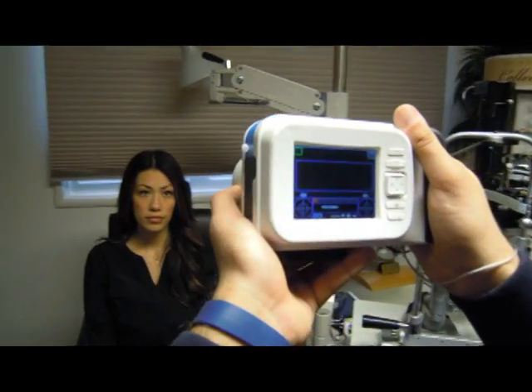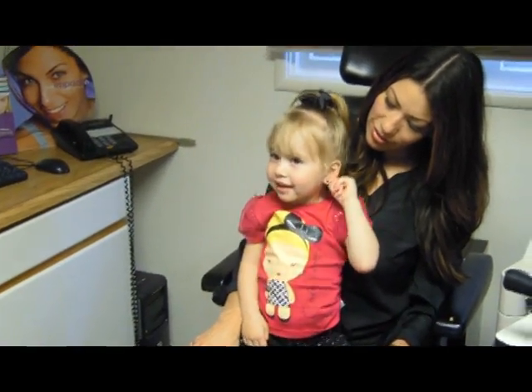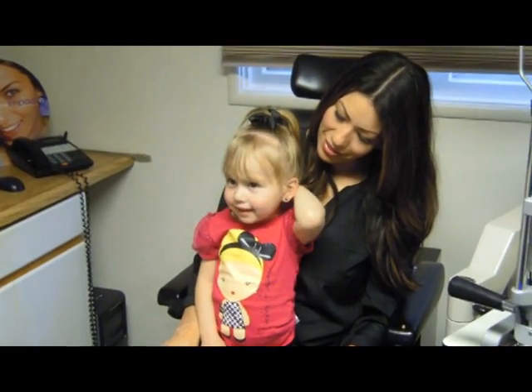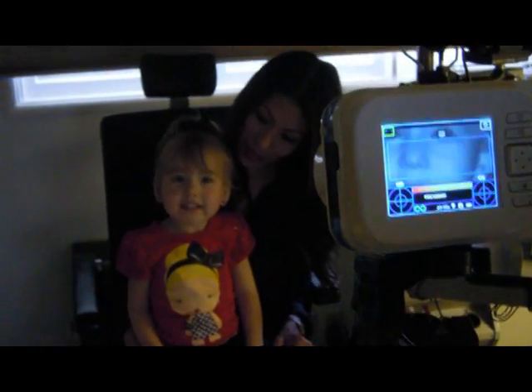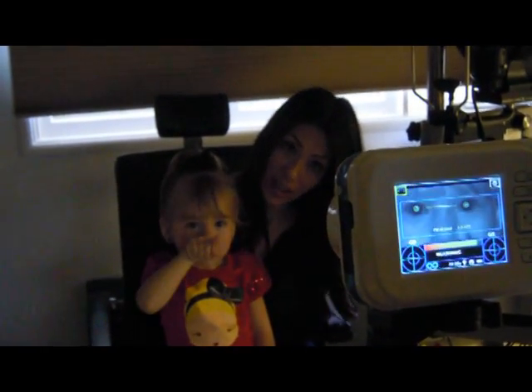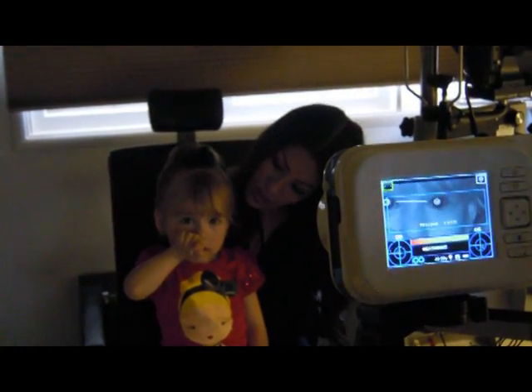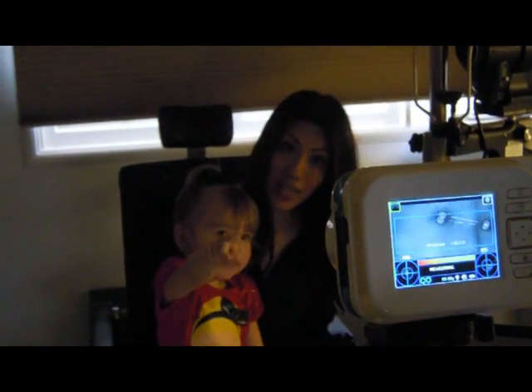In order to start taking measurements, the patient should sit comfortably in a suitable exam room. Infants should sit in an adult's lap. A uniform, dim light environment is necessary. The 2-WIN accuracy is affected by external sources of light. Please make sure no direct light hits the patient's face and ensure uniform light on both eyes.